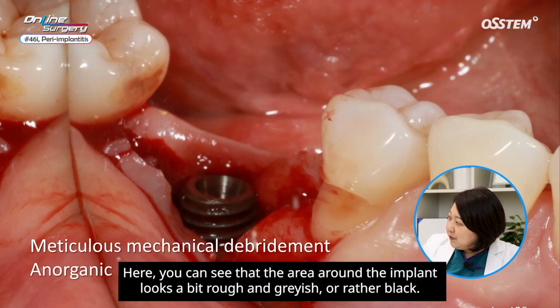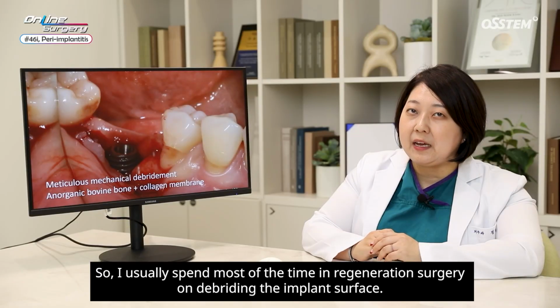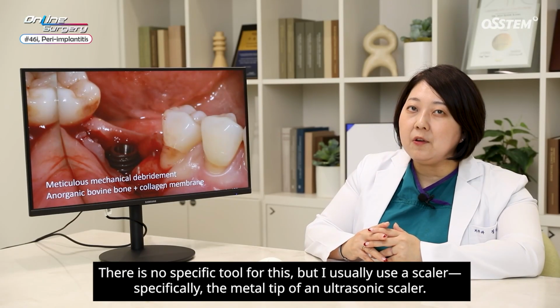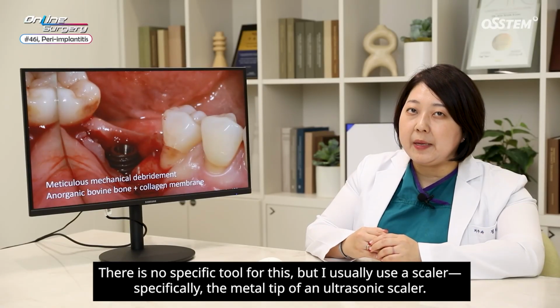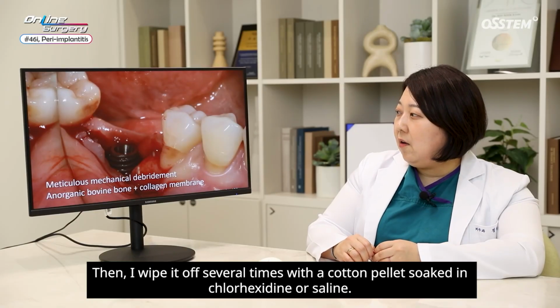Here you can see that the area around the implant looks a bit rough and grayish, or rather black. What matters before bone grafting is how clean you can make the implant surface. So I usually spend most of the time in regeneration surgery on debriding the implant surface. There is no specific tool for this, but I usually use a scaler, specifically the metal tip of an ultrasonic scaler. Then I wipe it off several times with a cotton pellet soaked in chlorhexidine or saline.